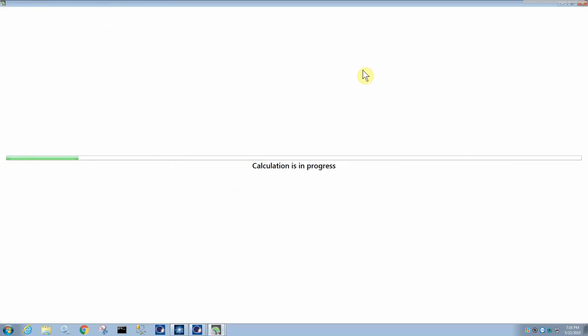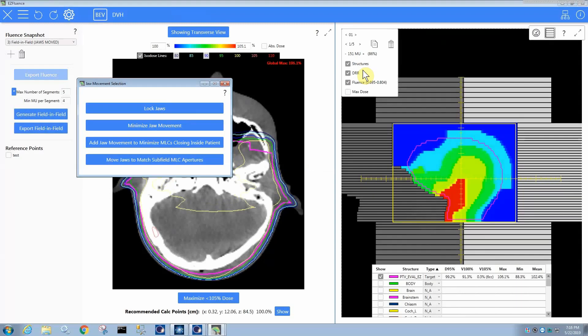Now when it generates a field-in-field, I wanted to demonstrate this real fast because this is a large field that has jaws bigger than the MLCs can move across the jaws. For Millennium MLCs, you can only move the MLC 15 centimeters away from the most open MLC, so you can't close all the way across the jaws, and therefore you might end up in a scenario where you need to choose whether you want to allow movement or not.